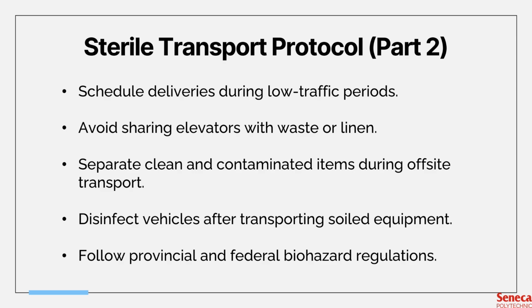After each soiled delivery, you have to ensure that the vehicle is disinfected before reuse. The vehicle could be the case cart itself or even the truck, for example, that's delivering them off-site. You always follow provincial and federal biohazard transport guidelines. These are non-negotiable for patient safety.